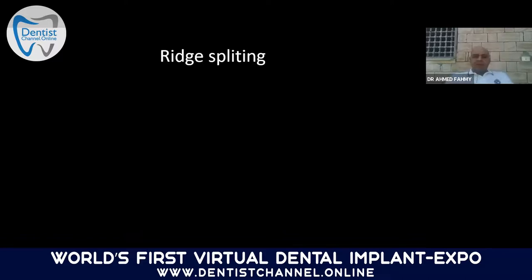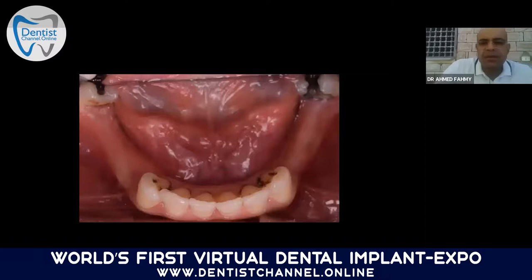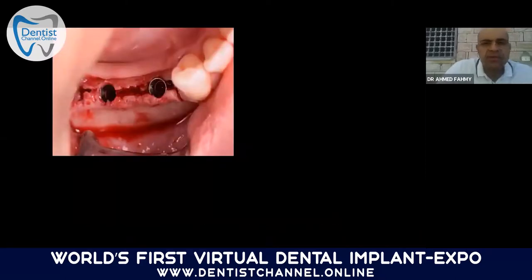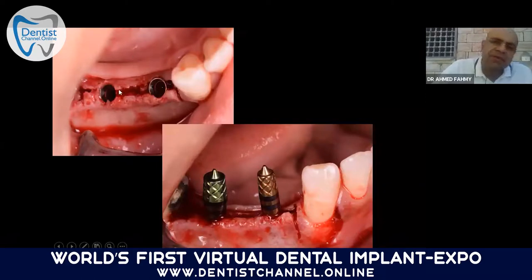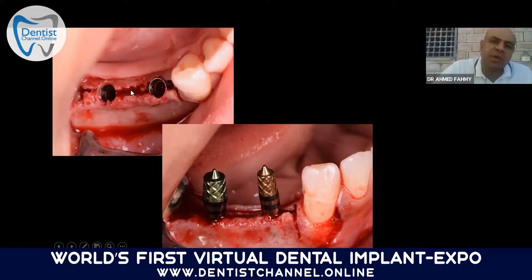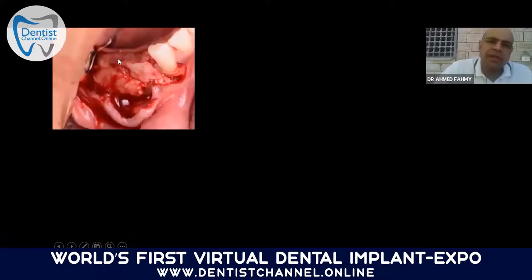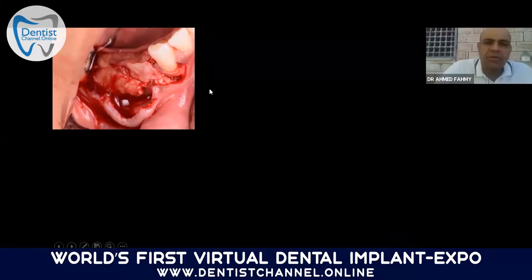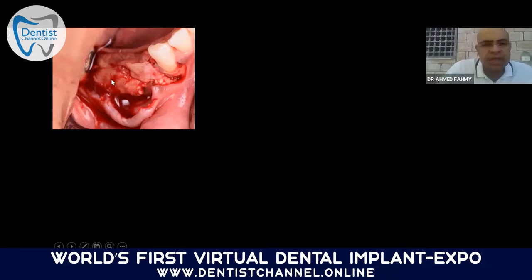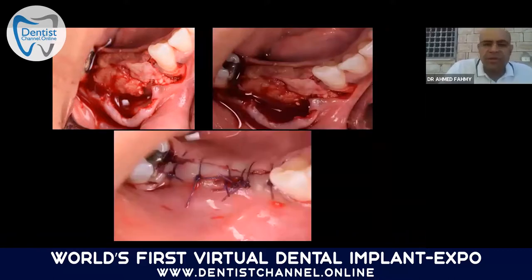Can PRF be used in ridge augmentation? Yes. In this case, the patient needs augmentation to place two implants. If the space is less than 1 mm, some schools say leave it; if more than 1.5 mm, it must be filled with bone. Here we fill the space with PRF only — not xenograft, not allograft, not bone from the angle of the patient's mandible. PRF can also be used sub-periosteally to improve soft tissue. After three months, excellent healing is achieved.